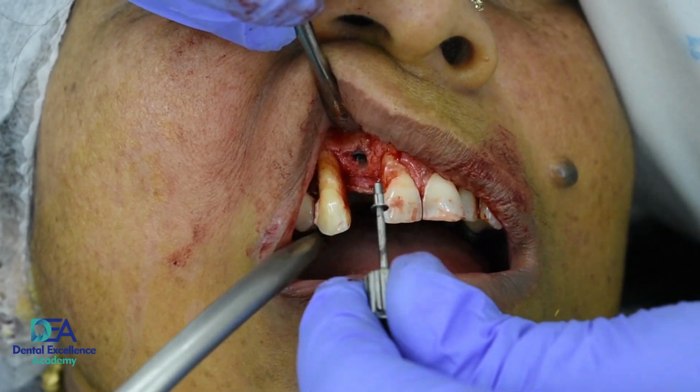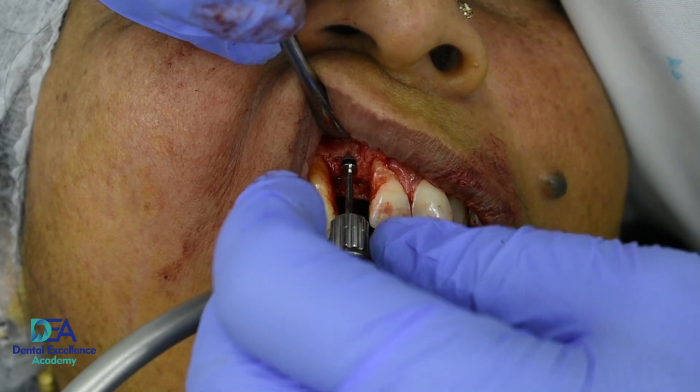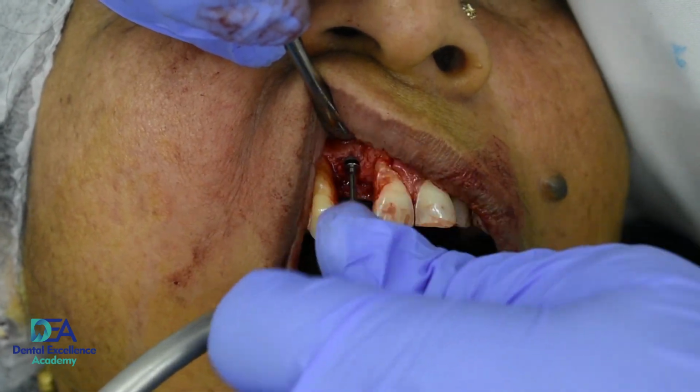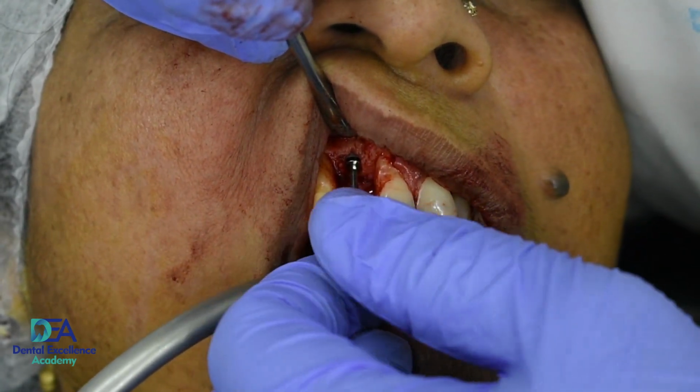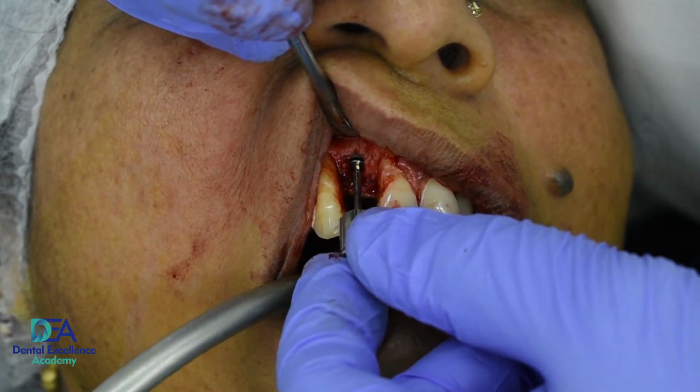So now I'm placing a cover screw because I'm not going to place a healing abutment in this case. So see the parallelism. Every time you have to check for the parallelism.